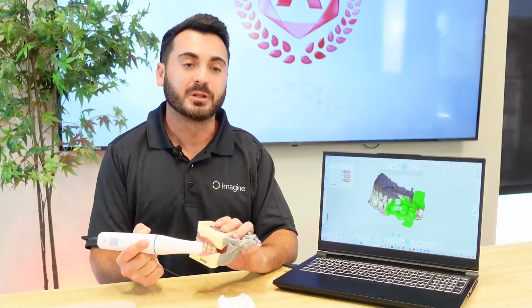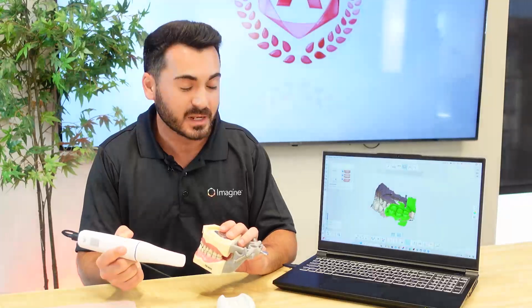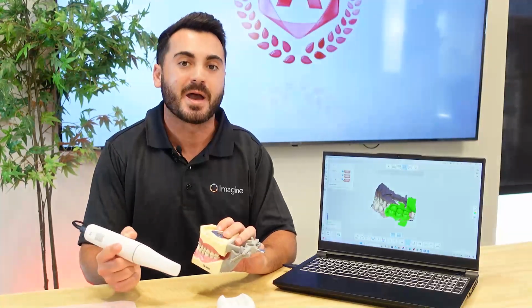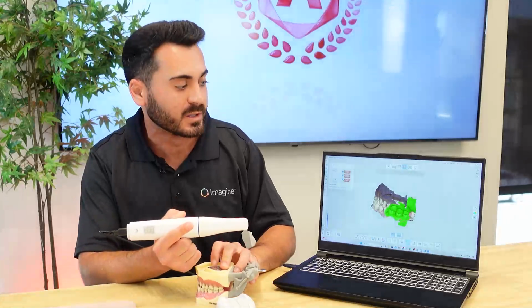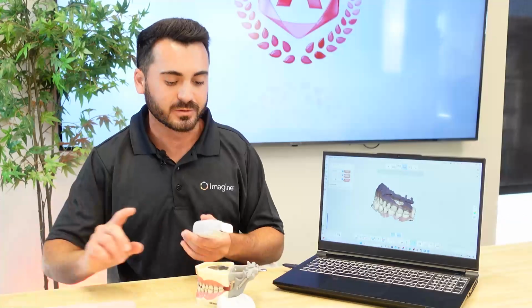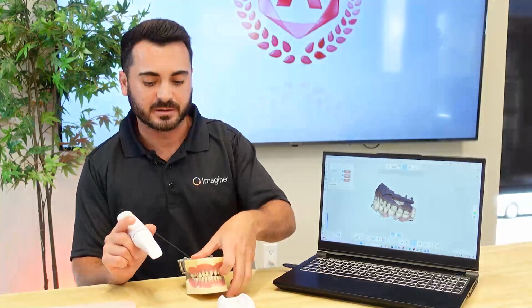It is possible for the occlusion to be captured immediately, but we always recommend picking up at least 3 to 4 teeth on both sides. So now that we've picked up one side, we can go ahead and switch to occlusion 2 and do the same exact thing on the other side.